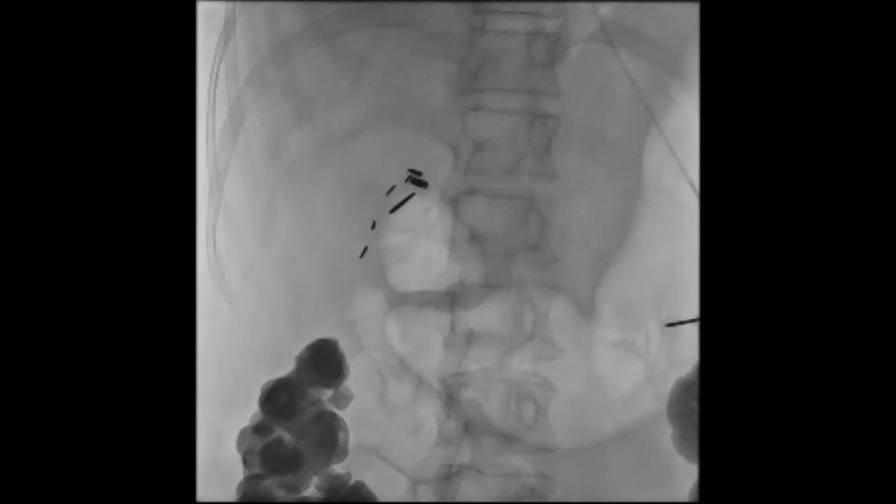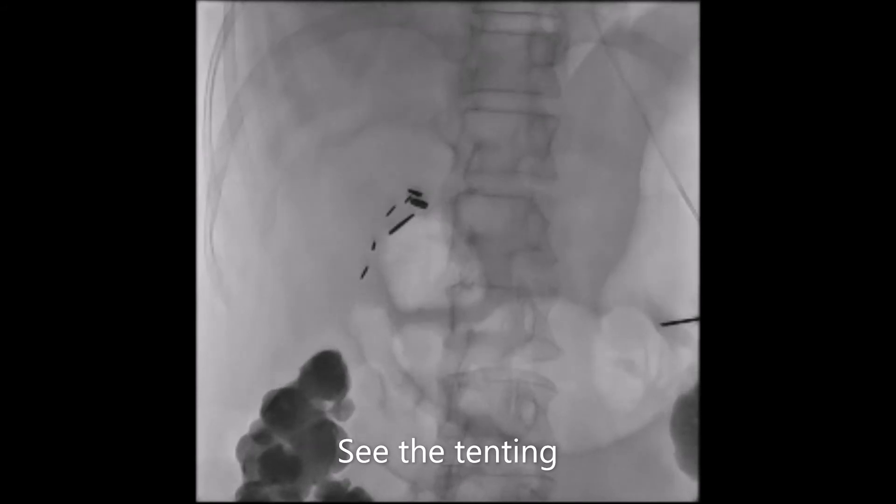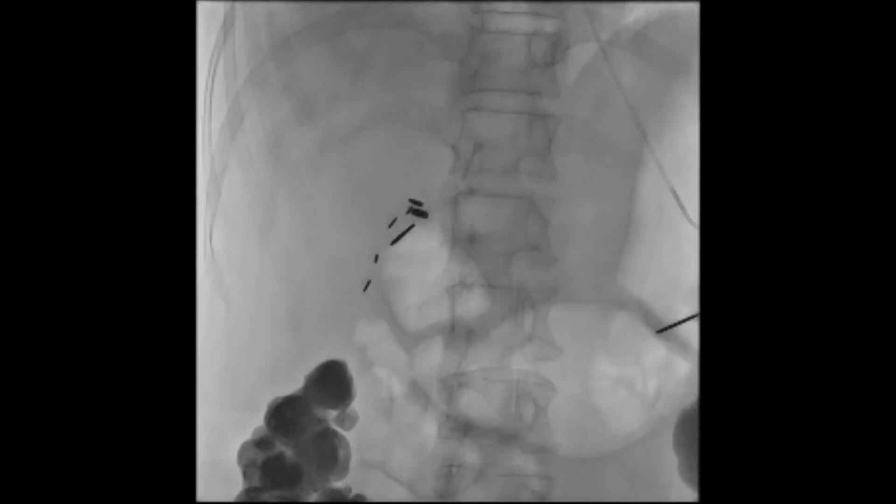Here is a slow-motion clip of me placing the first T-fastener. I've already seated the T-tack a few centimeters into the soft tissue while in the AP plane. After seating the needle, I rotate the C-arm away from me to the RAO projection. I position the C-arm so the tip of the needle is at the periphery of the screen to keep my hands outside the field of view. Slowly, I advance the needle until I see the gastric wall tenting. You can see the gastric wall tent at the needle tip. After tenting the wall, I make a short, quick advance to enter the stomach lumen, then aspirate air and inject contrast to confirm positioning.